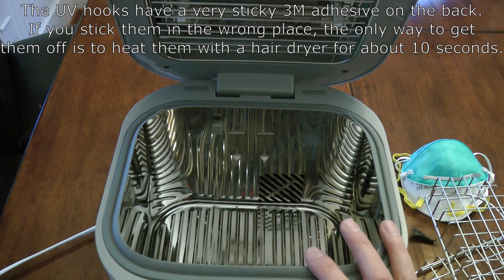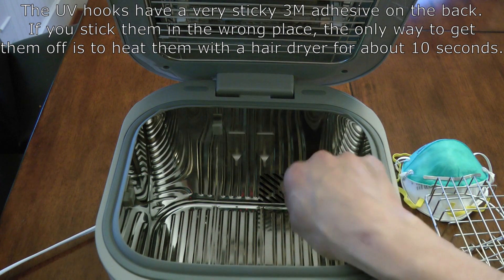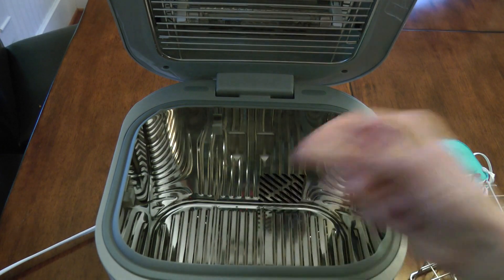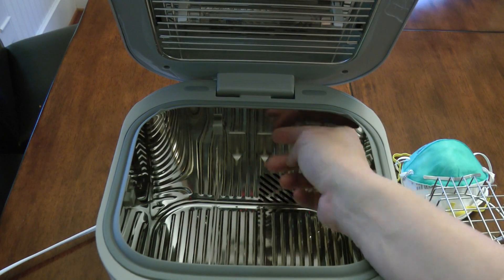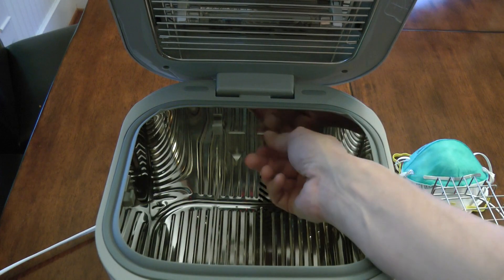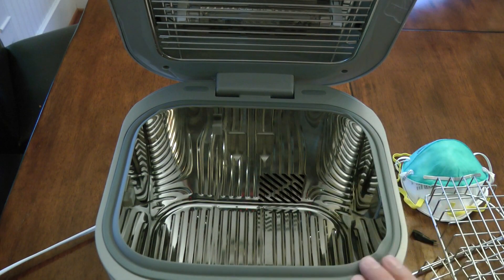The only way I know to get them back off without damaging anything is to take a hair dryer, put it on high heat for about 10 seconds, warm up the whole hook, then take the hair dryer away and just peel it off. The hook will probably be ruined from that because the adhesive in the back may stick to the wall, or it may just get curled up a little bit. So you'll have to use a new hook if you end up sticking one in the wrong location.